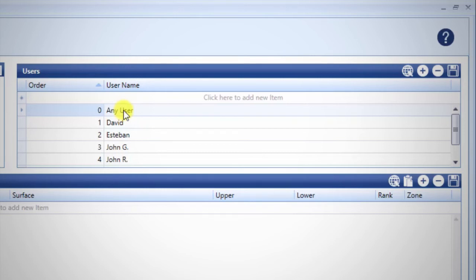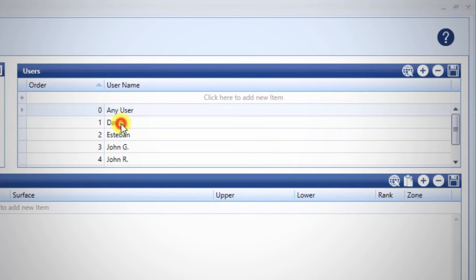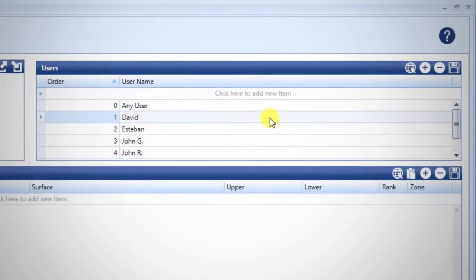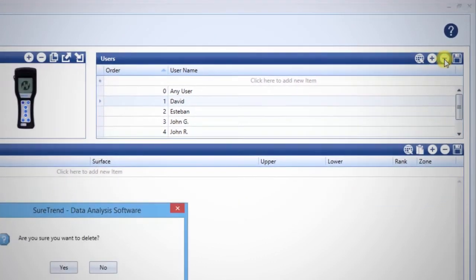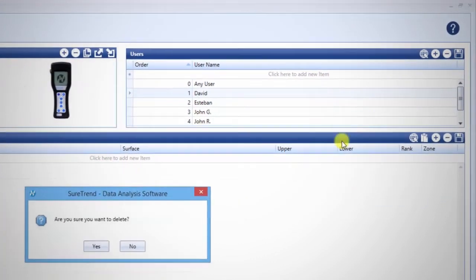To remove a user, highlight User and click the minus sign. Remember to sync your unit when you're done.